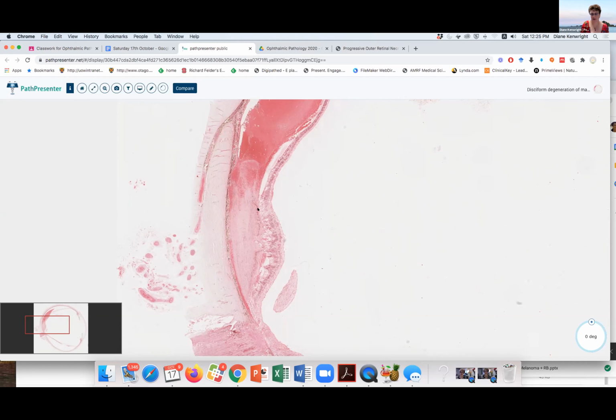Why is this happening, people? Tell us why this is happening. I don't know anything about this. I'd have to look it up on iWiki, which I might be forced to do if you don't tell us about it. Well, I presume this is degeneration, isn't it?